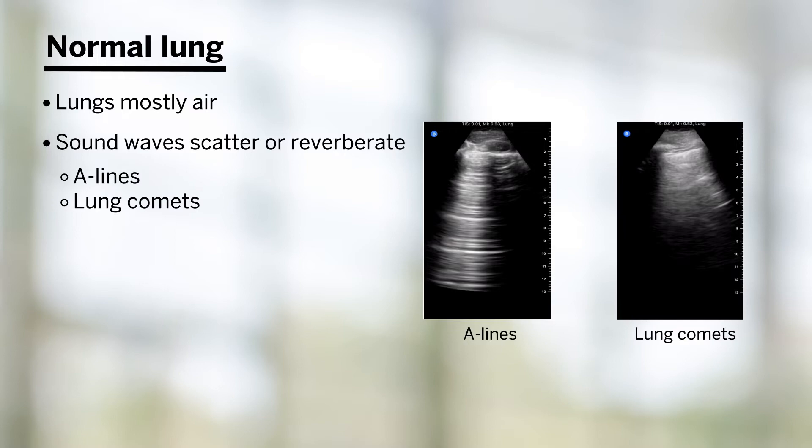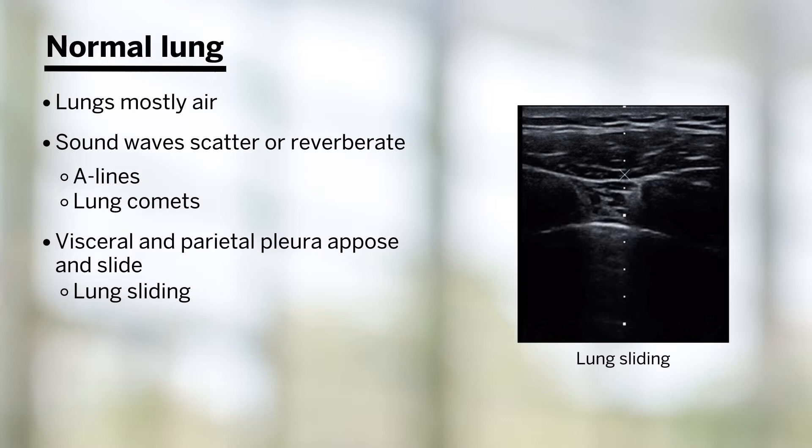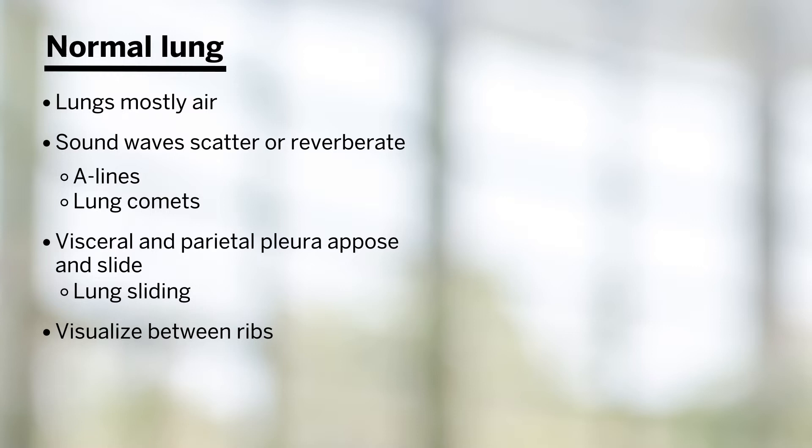Normal lung has visceral and parietal pleura that appose and slide upon each other, and this creates the sonographic finding of lung sliding. In general, we try to visualize it between rib spaces, since these dark, dense, and calcific structures often don't let sound through them.